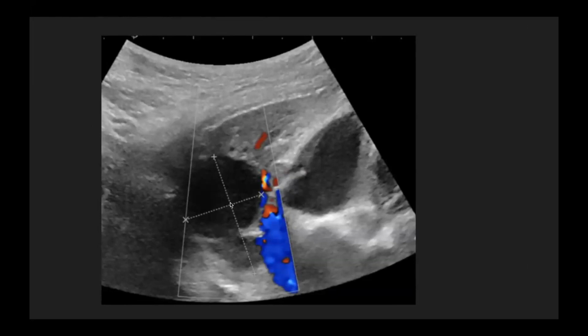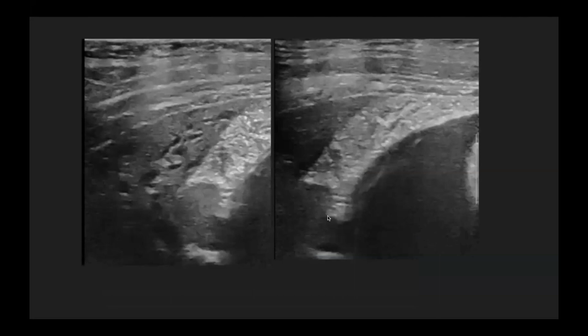So this is the right hemithorax. We could see a hypoechoic lesion between the cursors, and distal or peripheral to it, we could see the collapsed lung. This is the heart, which has come into focus because of the collapse. Now, the beauty of thoracic ultrasound is that it can differentiate the thymus from anything else so well. Here we can see the thymus showing the typical starry sky pattern. Just adjacent to it, we could see the collapsed lung with the parallel bronchi and the vessels.